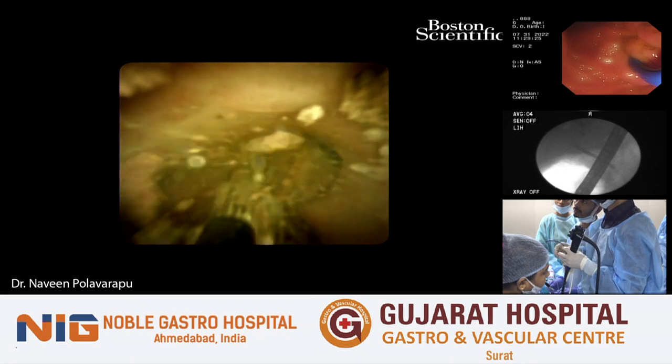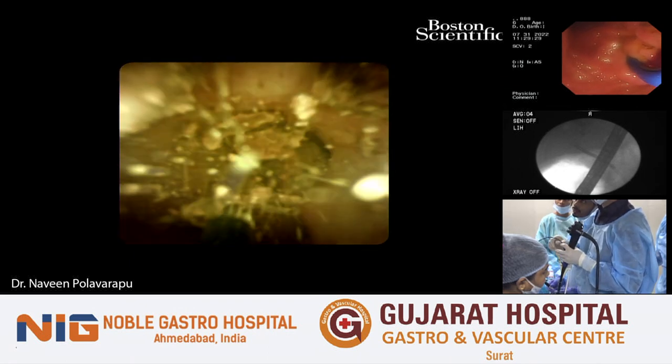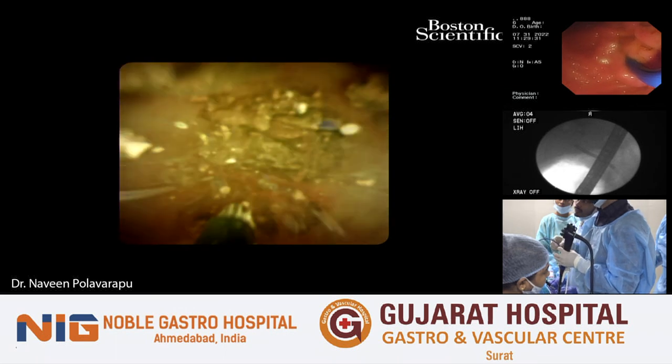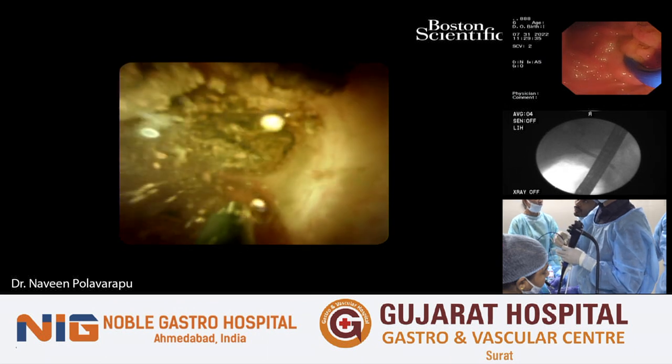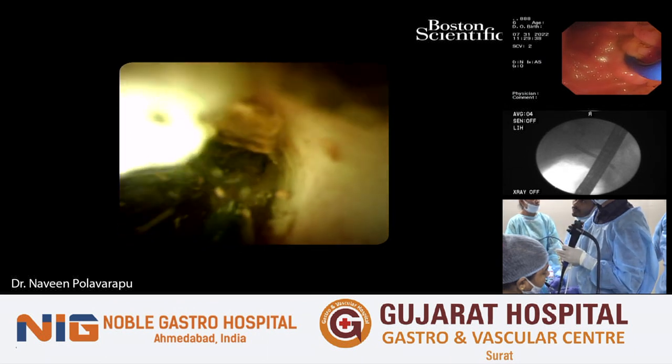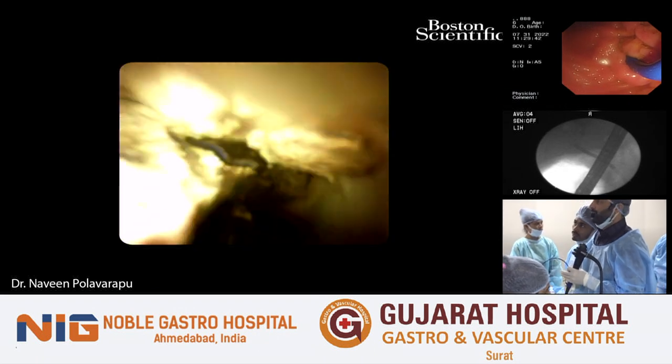I think we're done here. I think the stone seems to have broken enough. We should be able to take it out with the basket or the balloon. What do you guys say? Agree? Yeah, doctor. Sorry, Dr. Naveen, there is one question from Dr. Manas Vaishrao. Any standard setting recommended for EHL?